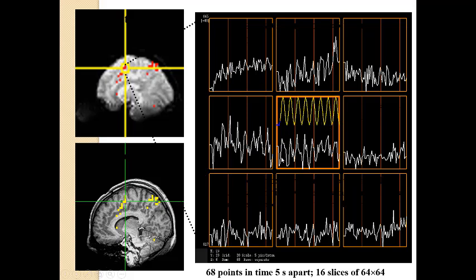AFNI then attempts to match what areas of the brain blood oxygen signal maps best to the example, the modeled prediction. And those are going to be the areas of the brain that are most likely to be associated with whatever task is at hand. So we can use the fMRI to literally detect thought. Right? There's some fascinating research that has been done. There's no way to cover even a tiny fraction of it, but here are some interesting ones.